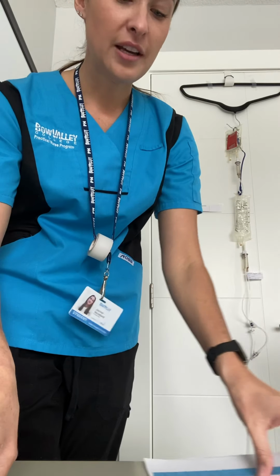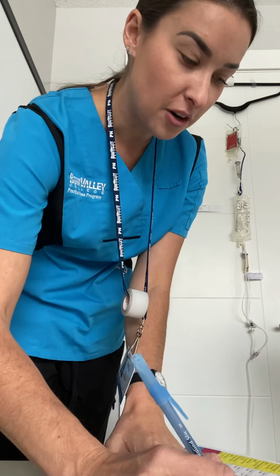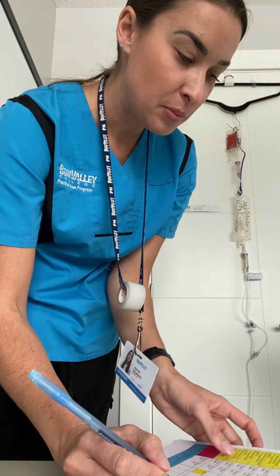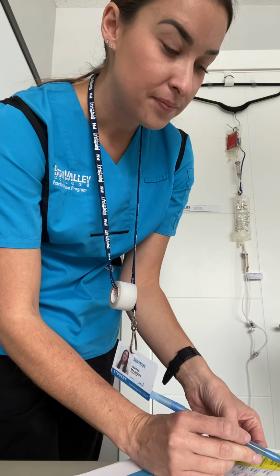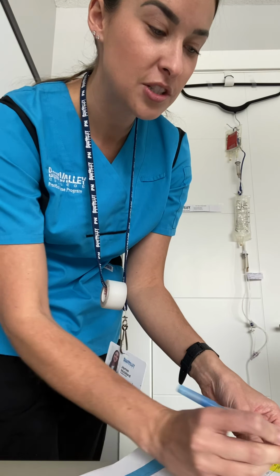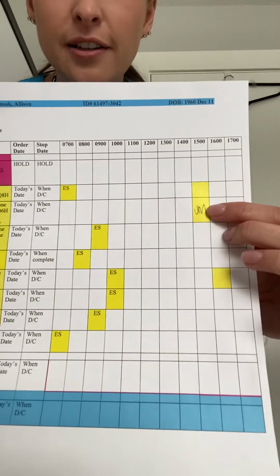So before I leave, I'm just going to sign off on the MAR that I've given dexamethasone 4 milligram IV piggyback after Allison's chemotherapy to Allison Chinook at 1500 hours on October 26, 2020. And there's my signature there.